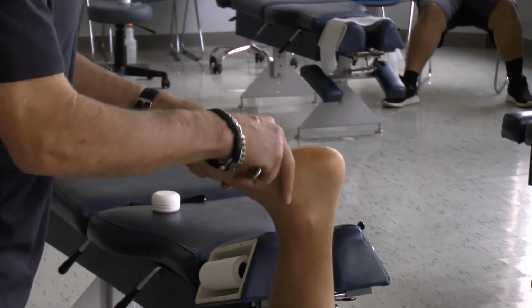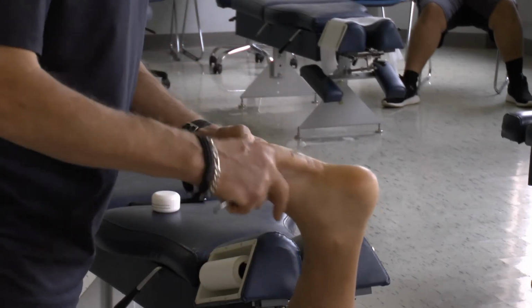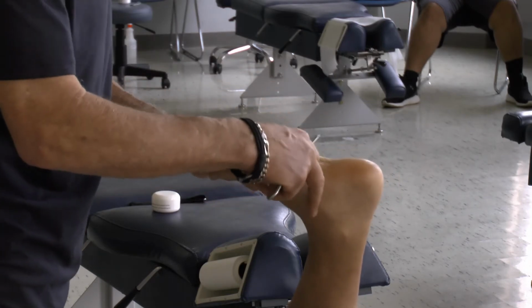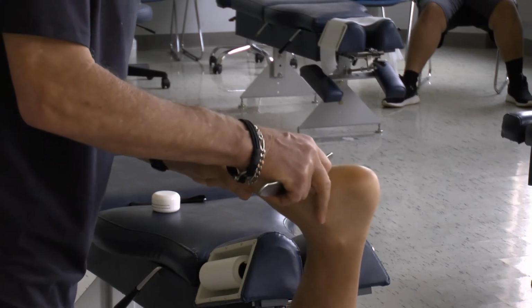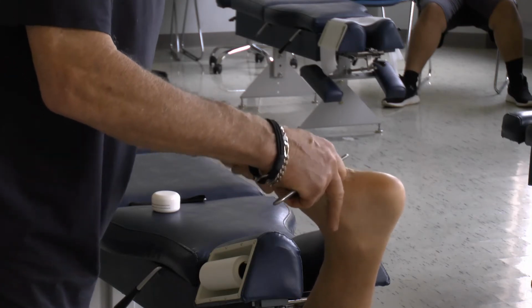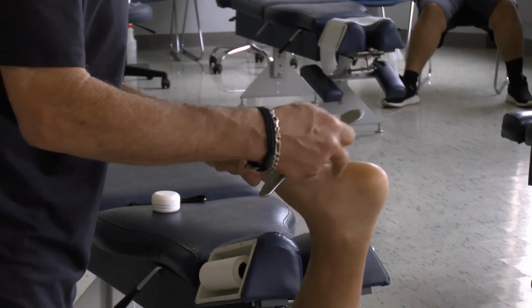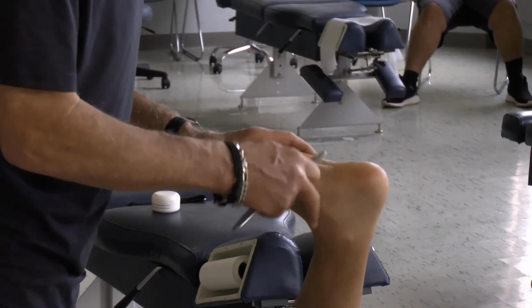So we have emollient on the bottom of the foot, and I'm using a single handhold and covering the entire plantar surface of the foot. This has to be done to patient tolerance. Some patients, when they're very acute, will not tolerate a lot of pressure in this region, so you'll have to use your discretion and experience to tell you how much you can engage the tissue. It also depends on when you're going to treat them again. If you're going to treat them in a couple of days, you're going to have to go a little bit easier than if you're going to treat them in a week, right? They will have time to recover from the treatment.